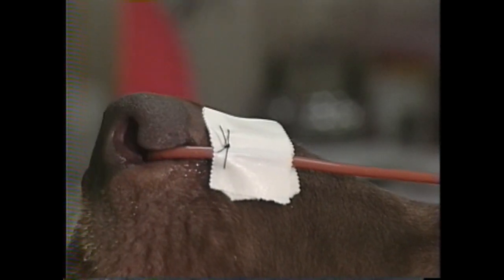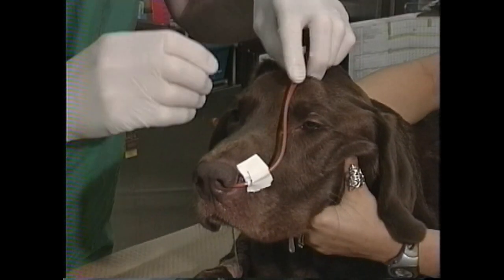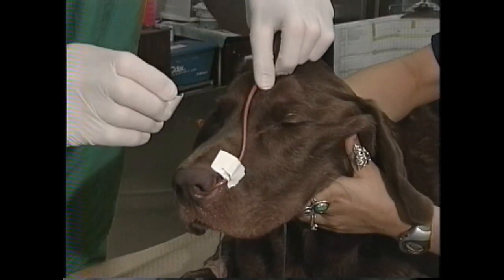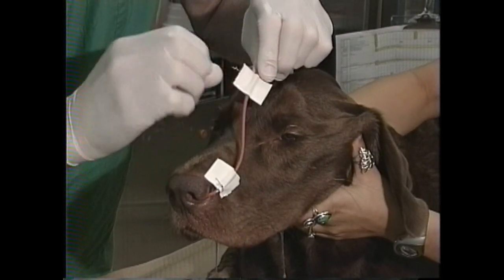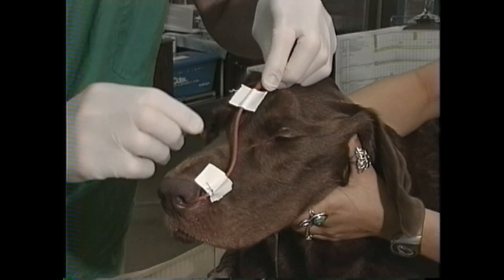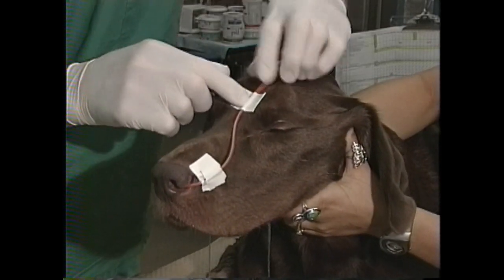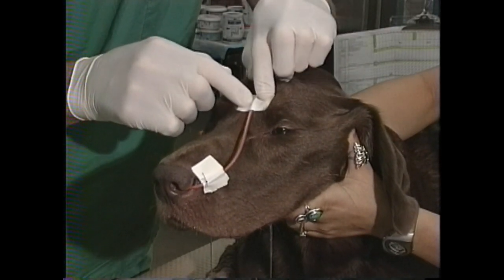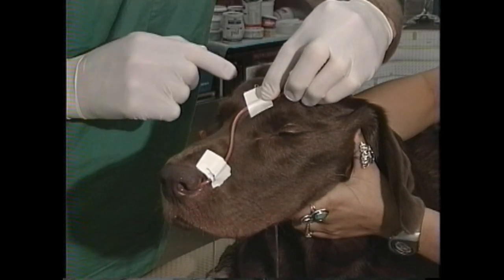If the width of the tape is too wide for the dog's face you can trim off the ends of this piece of tape to get it out of the dog's field of view. The next piece of tape is going to go over the frontal sinus, at the junction between the bridge of the nose and the beginning of the frontal sinus. This tape is a little bit too far back but I think it'll be acceptable. When we're done we're going to want the catheter running right in the middle of the dog's face.